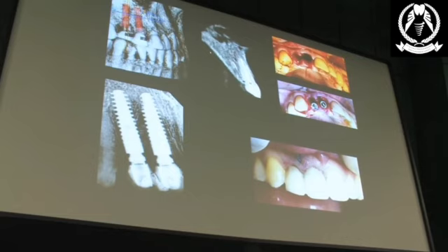We used to think that the bigger implants, these very tapered implants, were the ideal ones for immediate placement. They're not. It's parallel. The narrower you go, the bigger the buccal space, the better. The bigger the space between your implant and that very thin wall, the better, because we augment that space using something called BIO-OSS. That has proven to have better contact of bone to your implants, and you have better aesthetics for your patients.